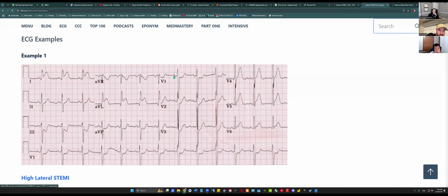Well, let's look at it. There's a P, there's a QRS. It looks funky, but look too, do you see the ST segment? Is this higher or lower than the baseline? Yeah, so this is a depression. This is also a depression if you start looking for it. Do you see how this is lower? This is lower as well too. So there's a lot of depressions here.